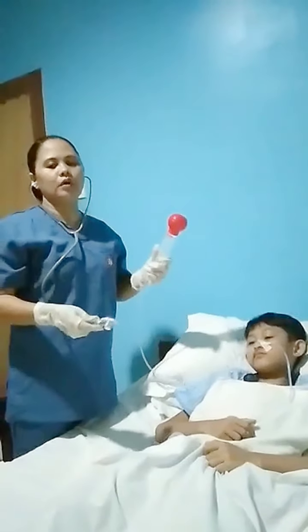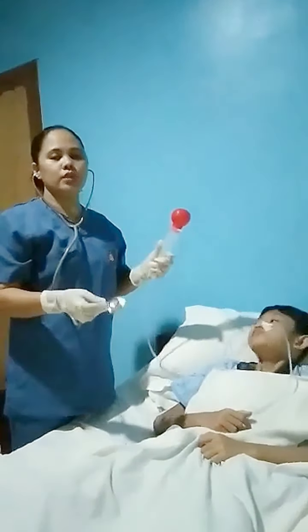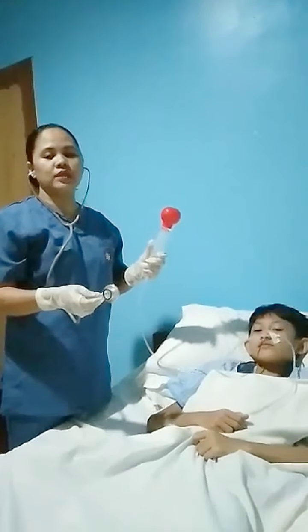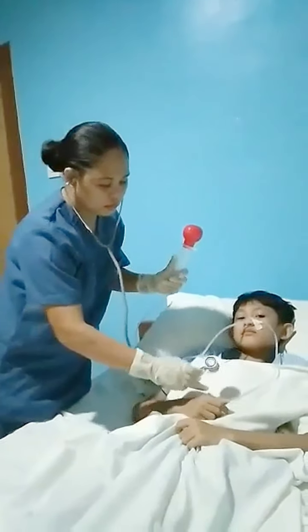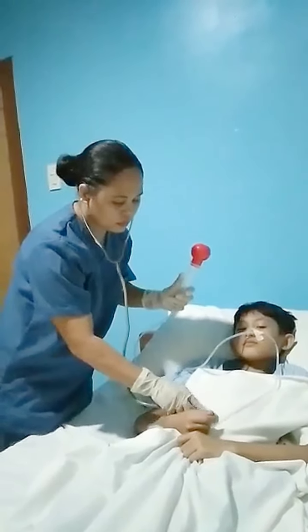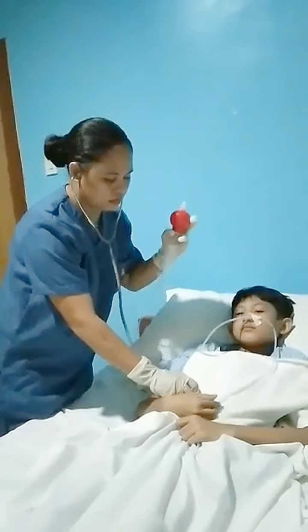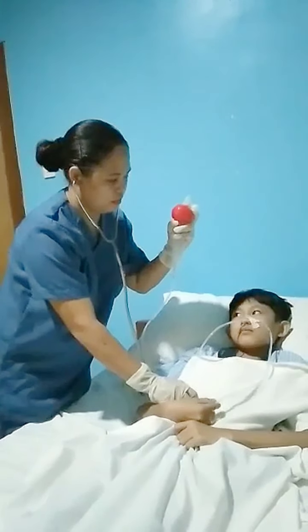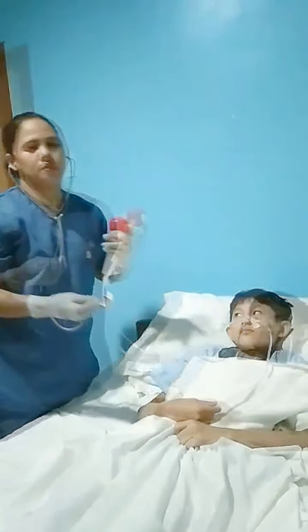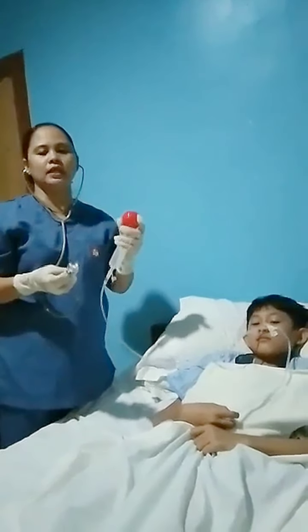Now, put the diaphragm over the epigastric area to listen for the borborygmi sound as we introduce 10 to 15 ml of air in the patient's stomach. Okay, and the borborygmi sound should be clearly heard if the tube is properly in the stomach.